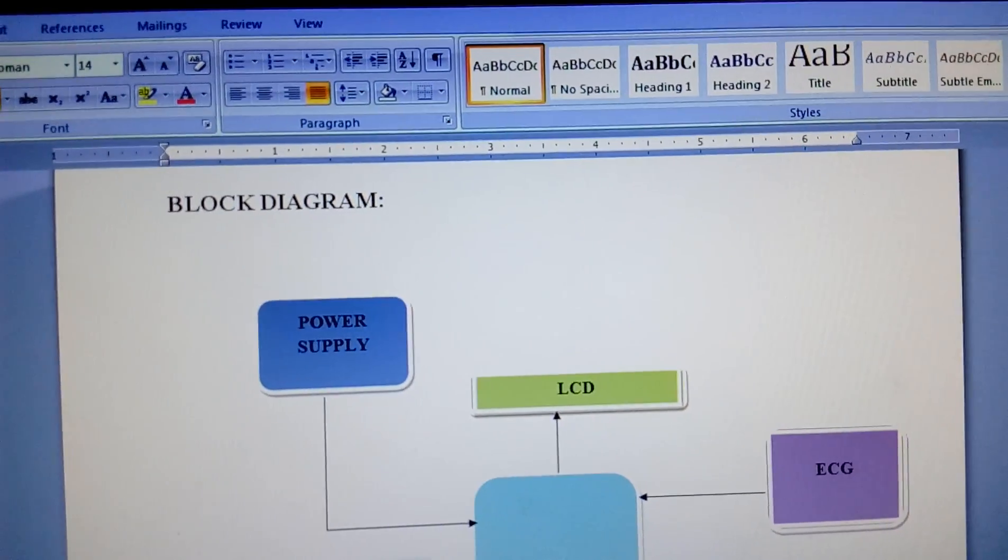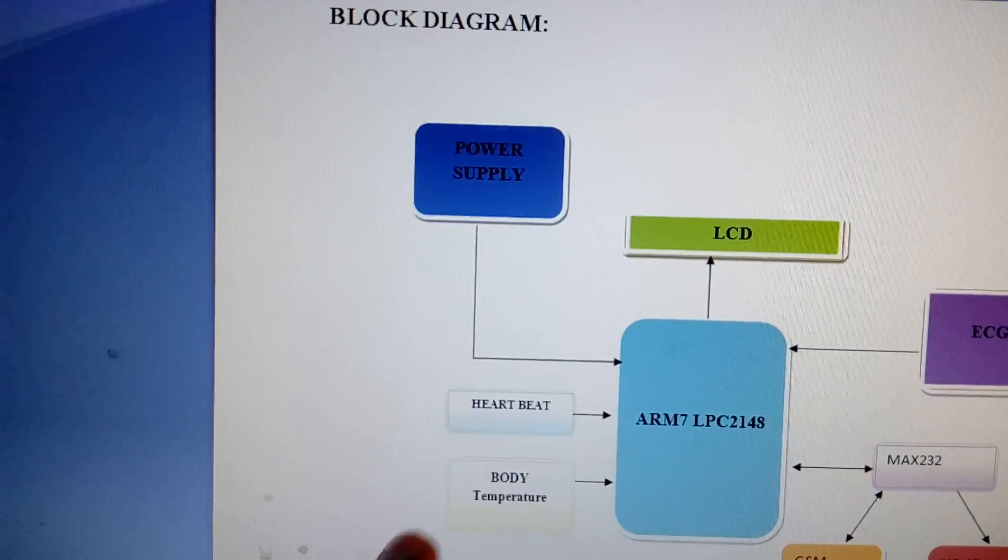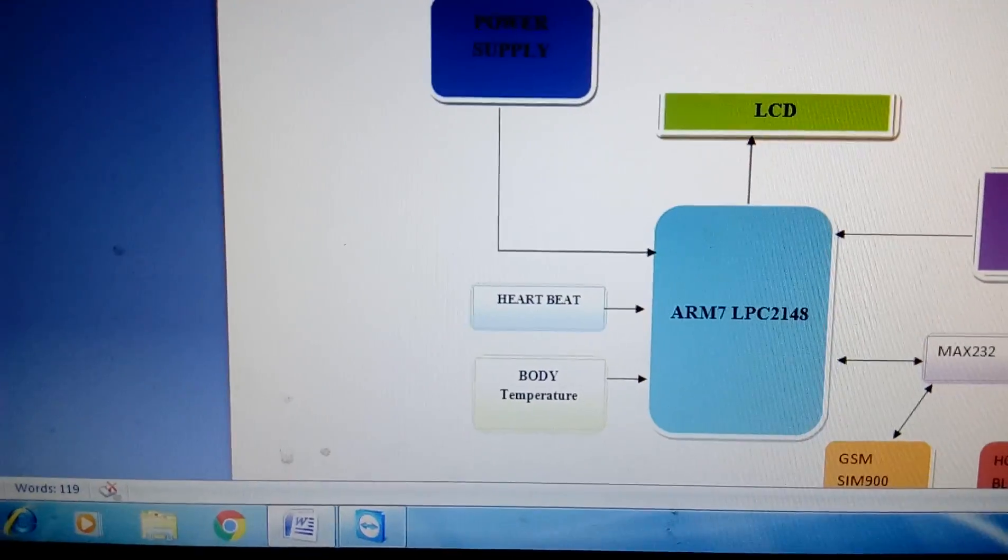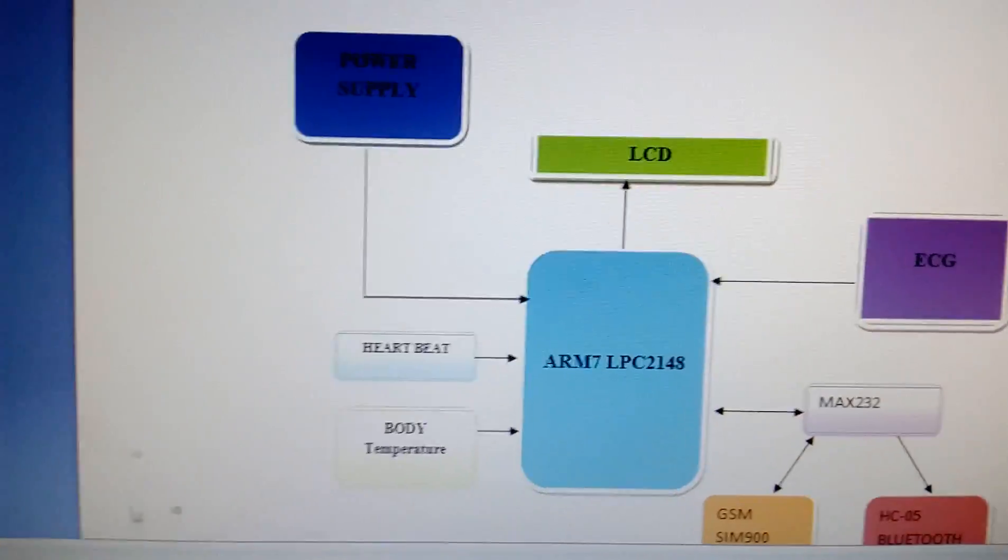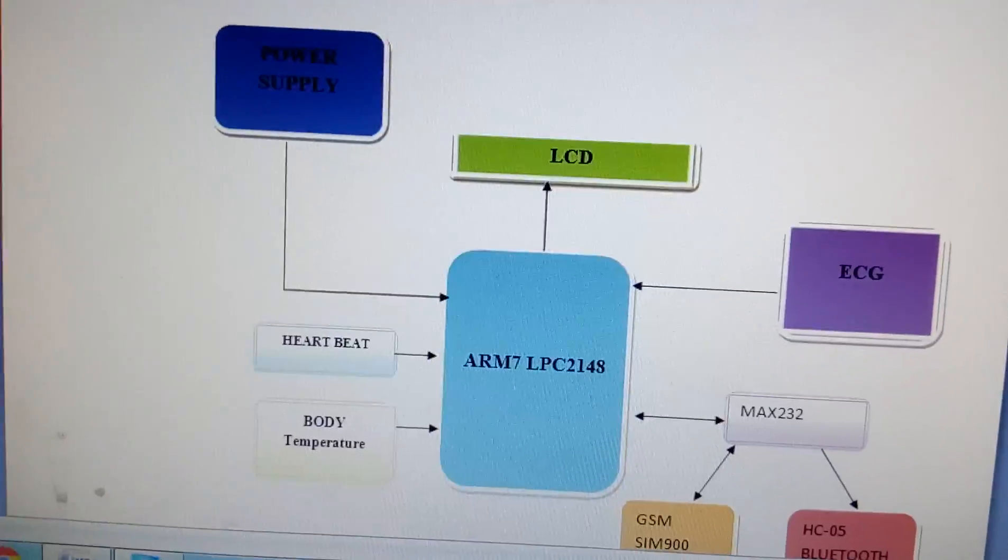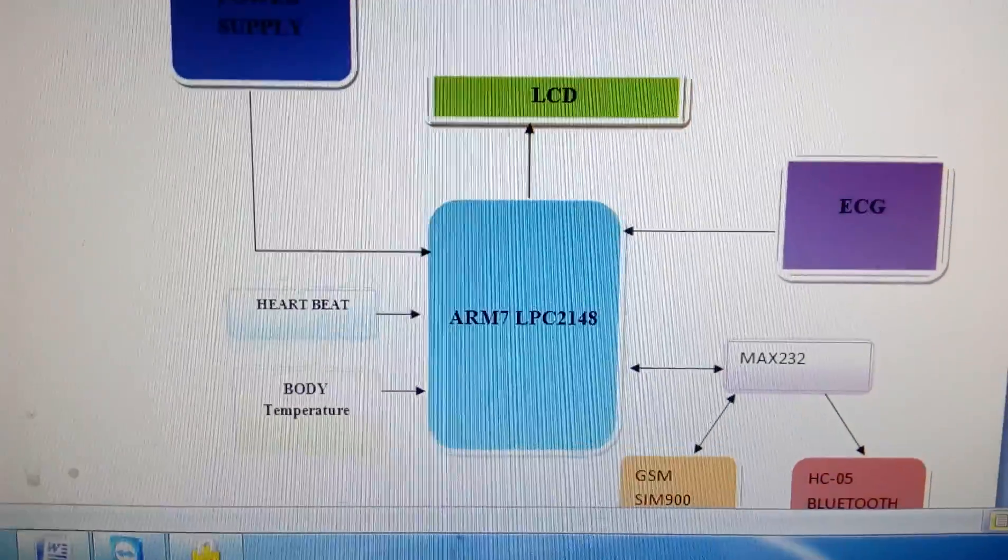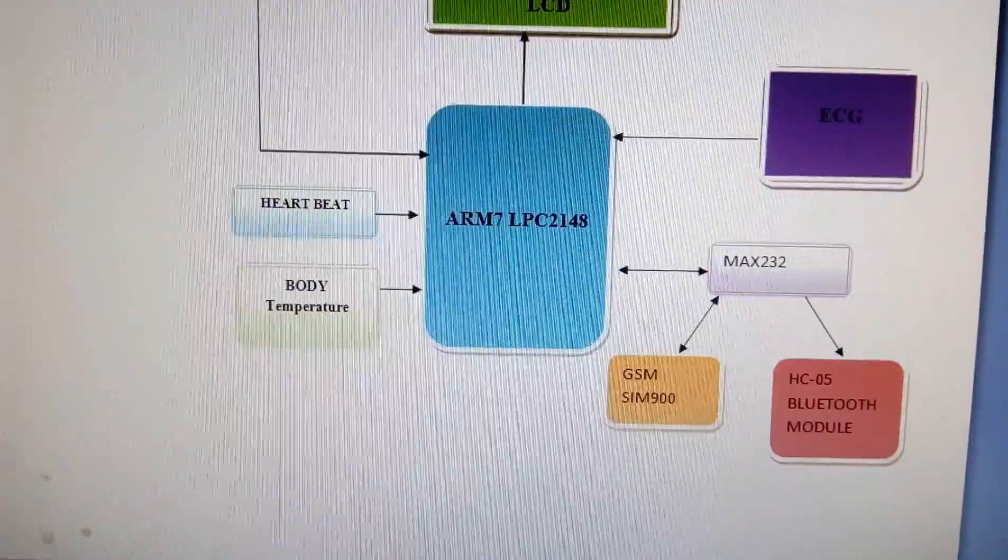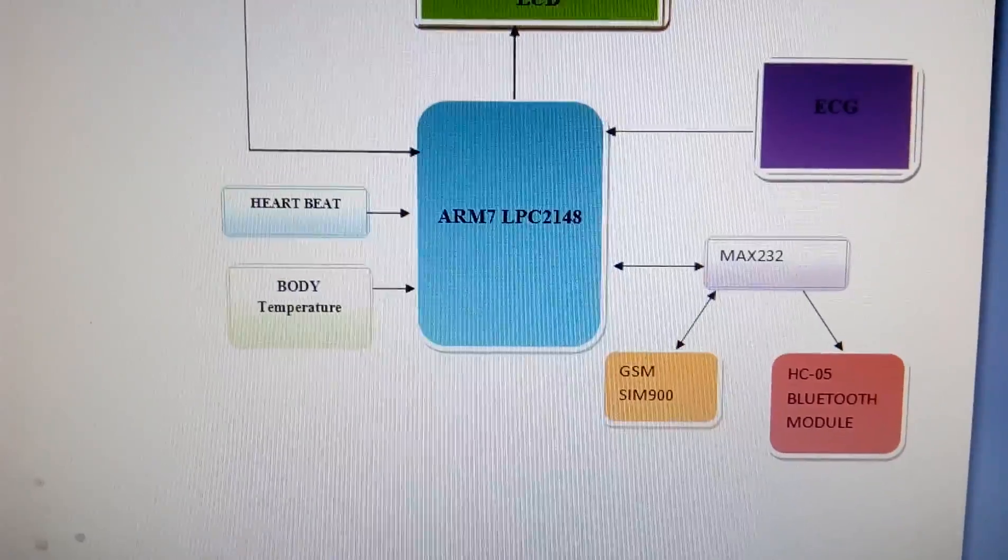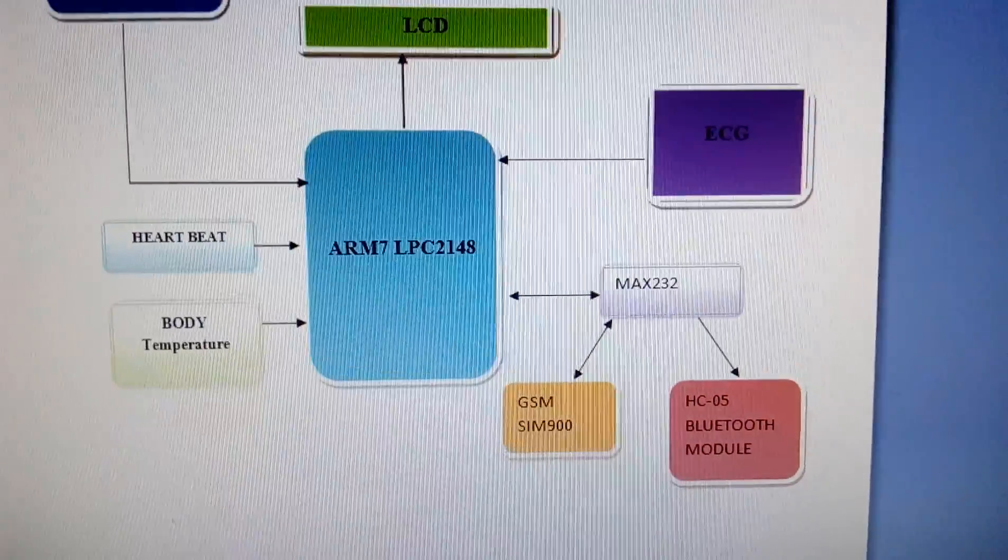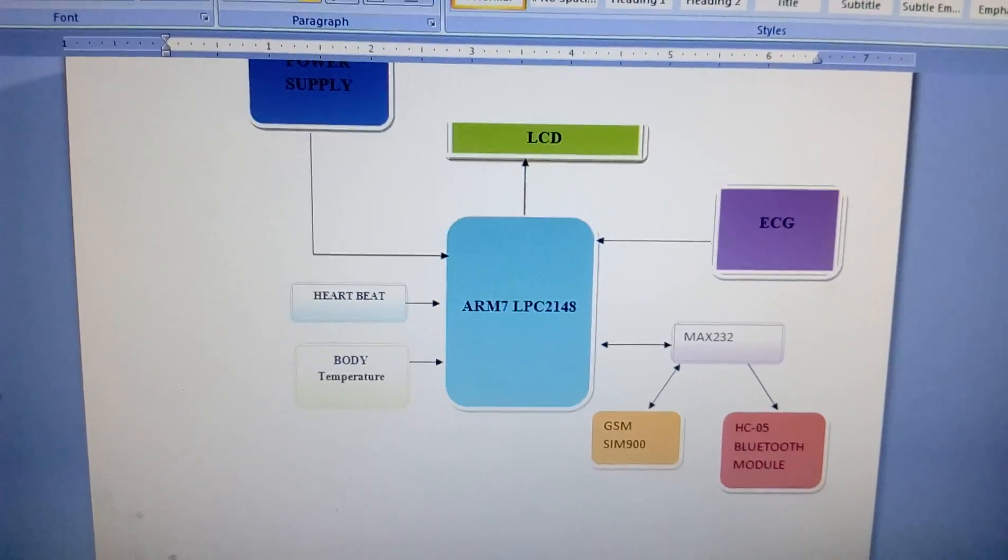We have a 16 by 2 LCD display character LCD display and one heartbeat module. We are using one body temperature LM35 temperature sensor and one ECG module. One MAX232 is a level converter voltage level stabilization IC and one GSM GPRS module SIM900 and one HC05 Bluetooth module. This is my entire block diagram section.